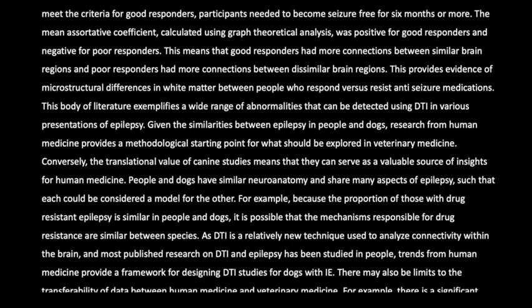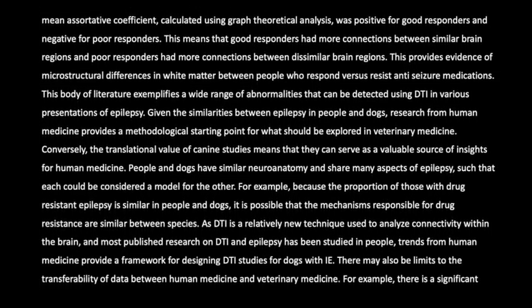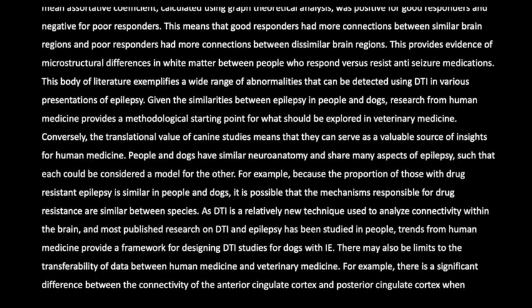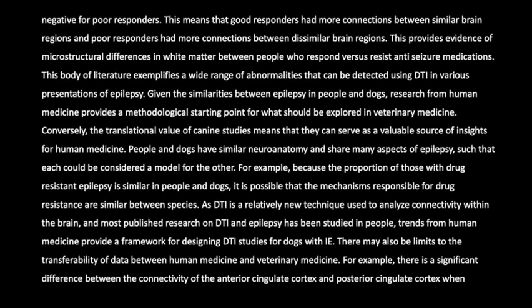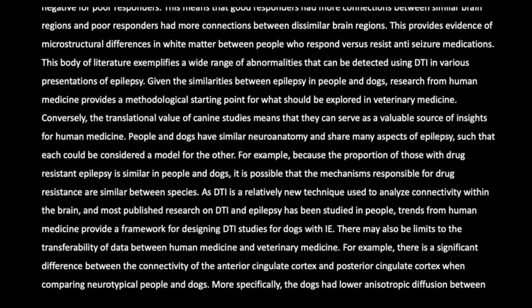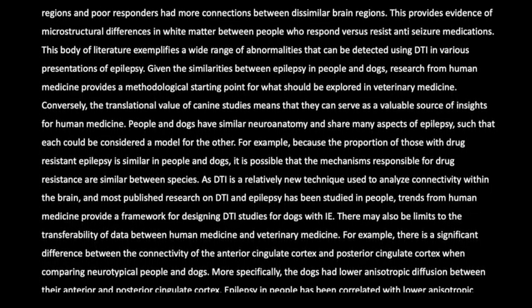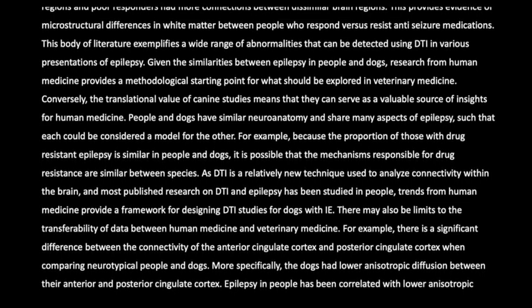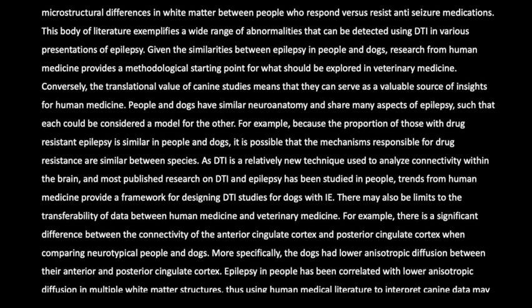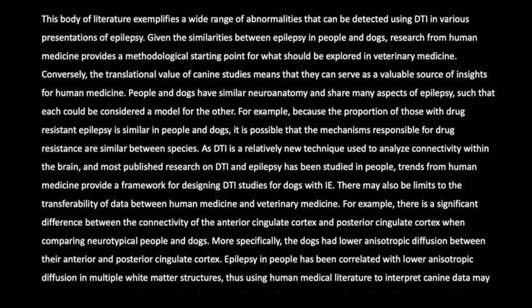This body of literature exemplifies a wide range of abnormalities that can be detected using DTI in various presentations of epilepsy. Given the similarities between epilepsy in people and dogs, research from human medicine provides a methodological starting point for what should be explored in veterinary medicine. Conversely, the translational value of canine studies means that they can serve as a valuable source of insights for human medicine.